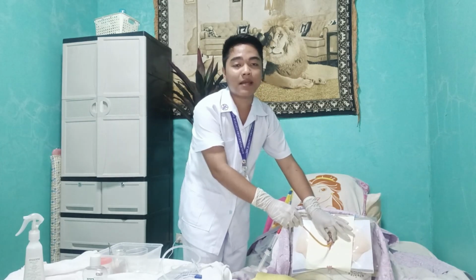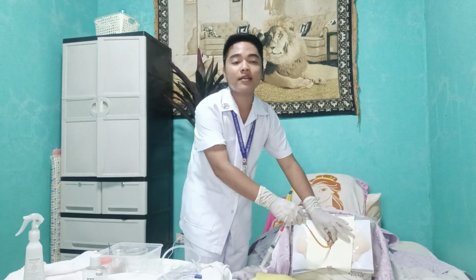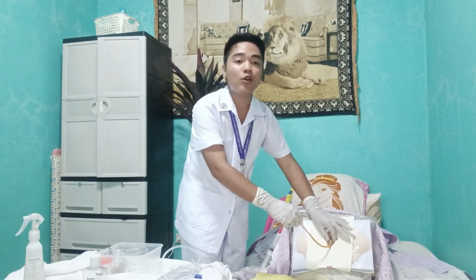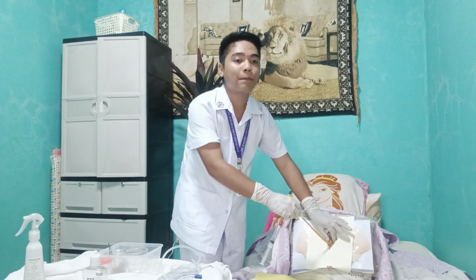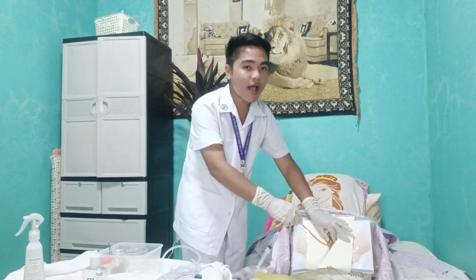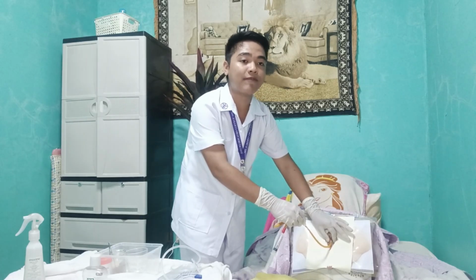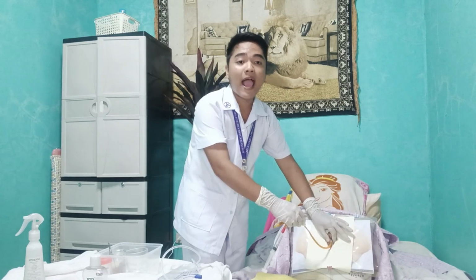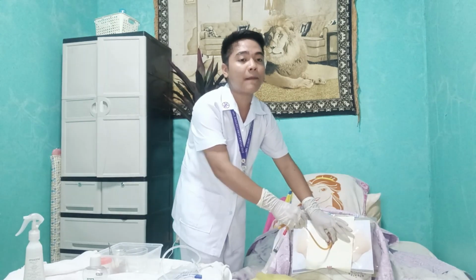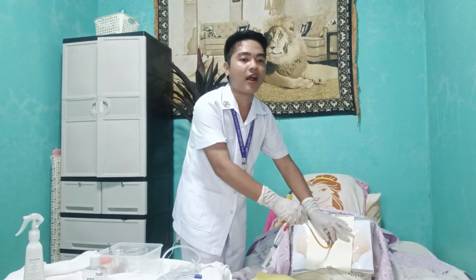Now, if a specimen needs to be collected, pinch the catheter because the urine will flow out if the lumen is not occluded, and place the specimen container in place. Now, rest the hand on the patient's pubis while holding the catheter in place to avoid pushing and pulling the catheter, because withdrawing and pushing the catheter back in the urethra may cause an infection of the urethra.